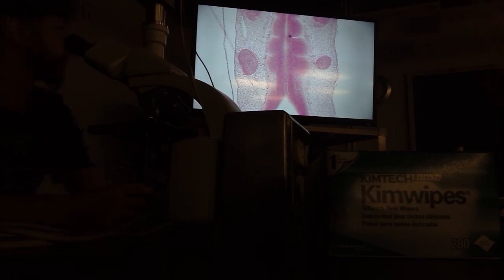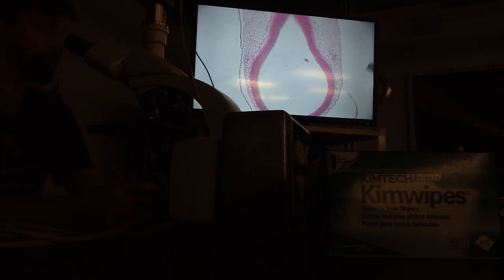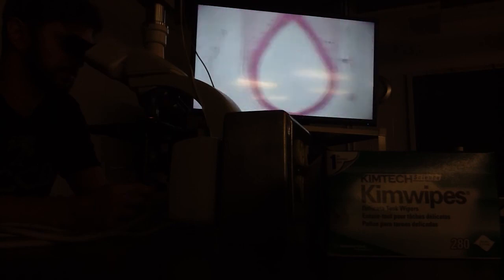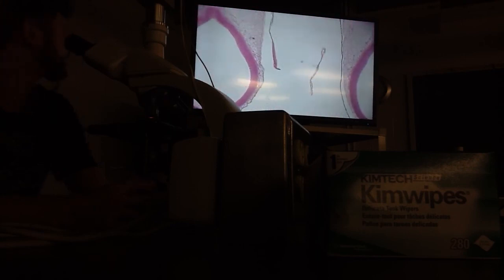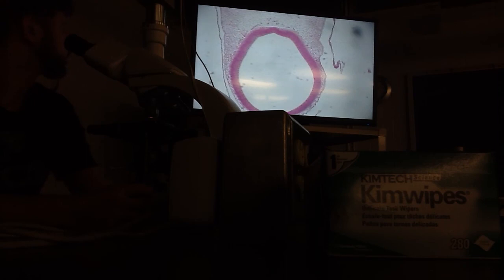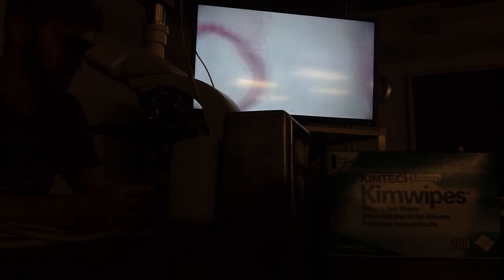So here's what we're going to do now. Come down here, sir. We're going to follow this part of the brain to the anterior. Look, following it like this to the anterior. And then we'll come back to this region and follow it to the posterior. Let's follow this to the anterior, please. So we're going through which part of the brain? Mes. There is a signature of the mesencephalon. Stop. No, I don't see it yet. Keep on going. Okay. One more.